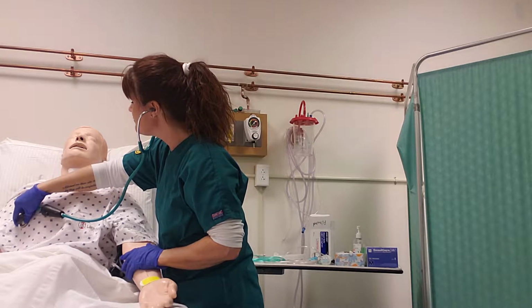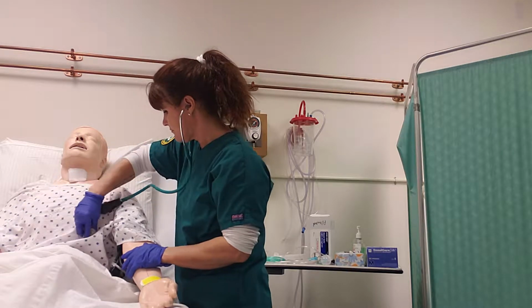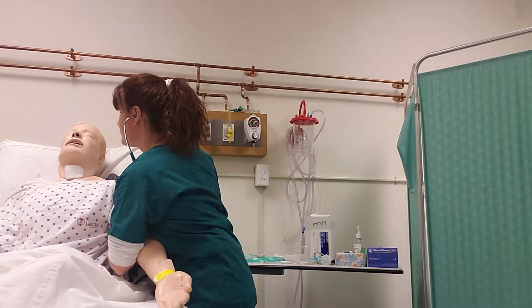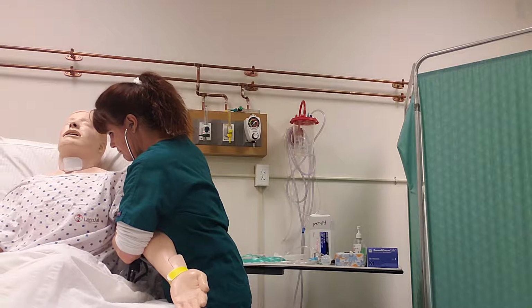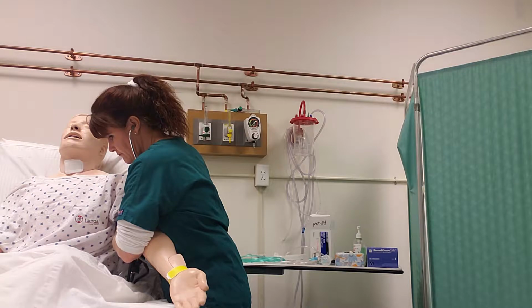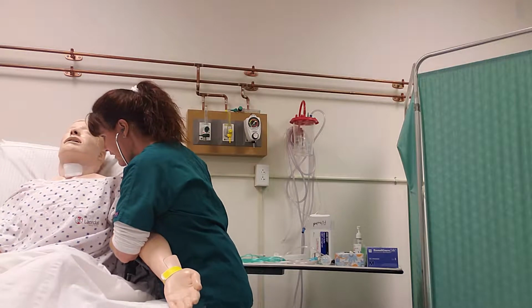You take a deep breath for me. Another deep breath. Thank you. All right, I'm going to check back here for you. Here, you take a deep breath. And another. Okay, one more. And again. All right, thank you.